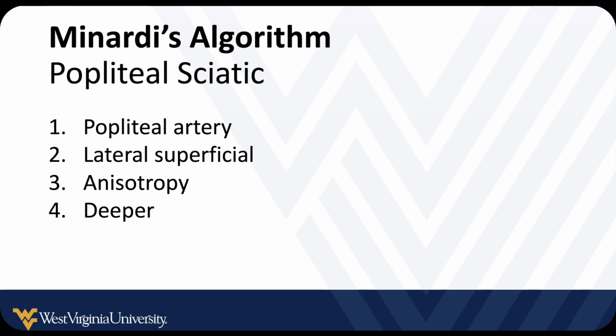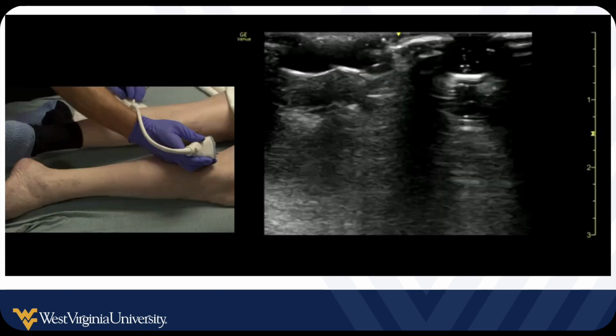For this one, I typically do the same mixture that I use for the fascia iliaca block. I'll just take 20 mLs of 0.25% bupivacaine, 20 mLs of sterile water or saline. It doesn't usually take the whole volume in this case, but I make sure I just have that already there and ready to go. And just one more look at identifying the anatomy to help you systematically recognize that nerve and how to find it.